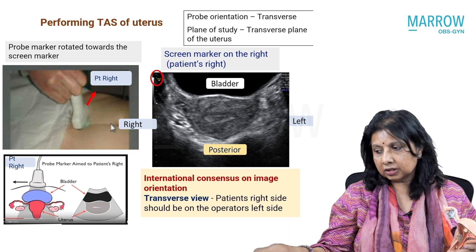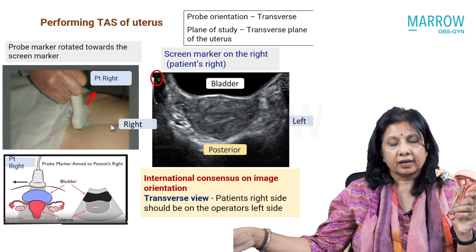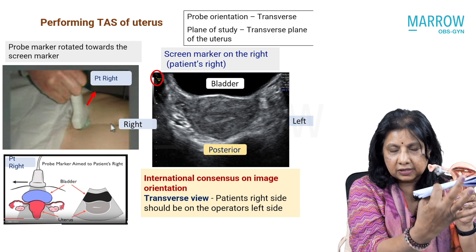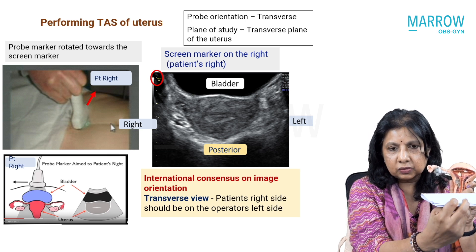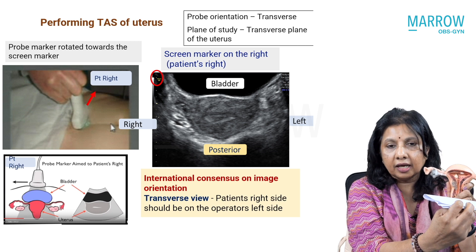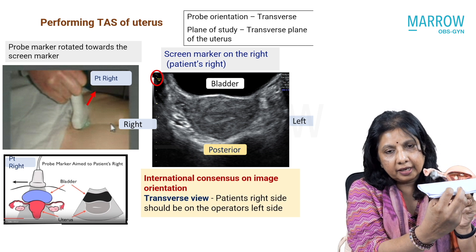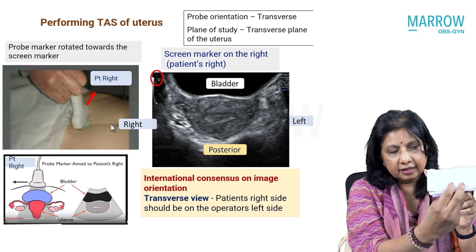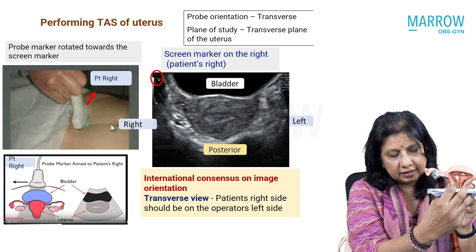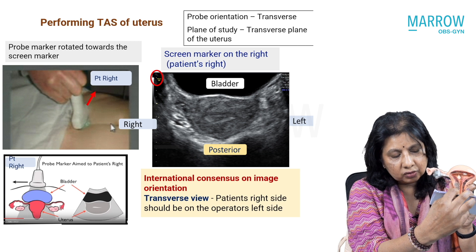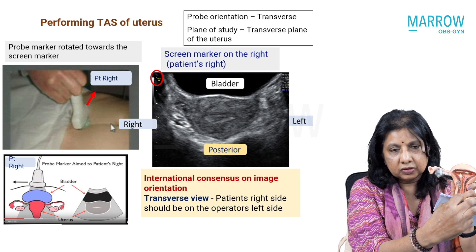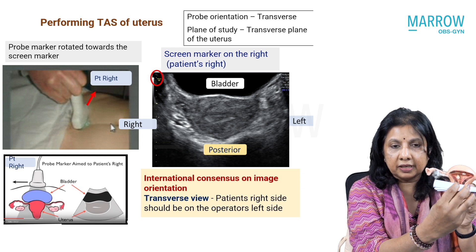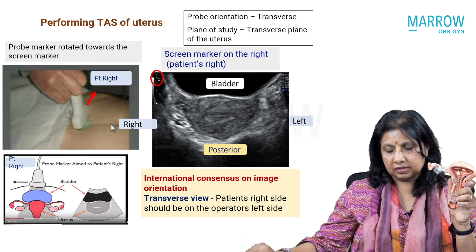So in order to study all the planes, I will actually sweep. Because this is a fan, I can't sweep it sideways — I am sweeping up and down. When I'm going up, I always say go up so that you lose the fundus, then come to the body of the fundus. And then when you go down, you'll look at the cervix. So I am evaluating the entire uterus in transverse planes, right from the cervix to the fundus.